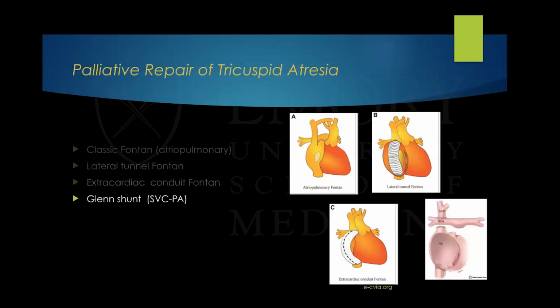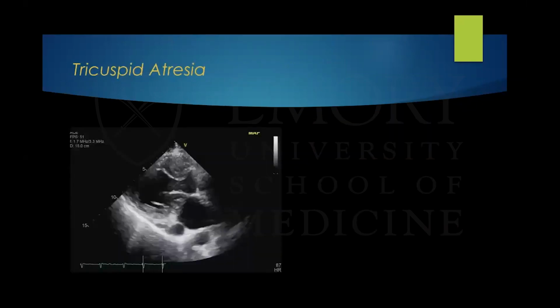And the other part of the Fontan repair is the Glenn shunt, where the superior vena cava is now sewn into the right PA, and it's no longer part of the right atrium. You can also have, if you have two SVCs, two Glenns, the bilateral Glenns.